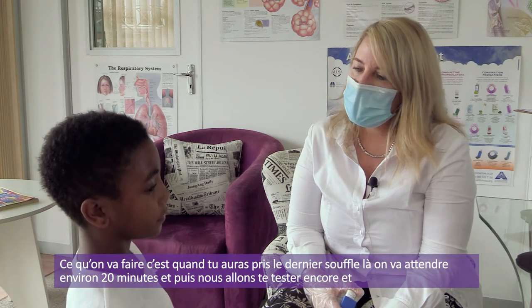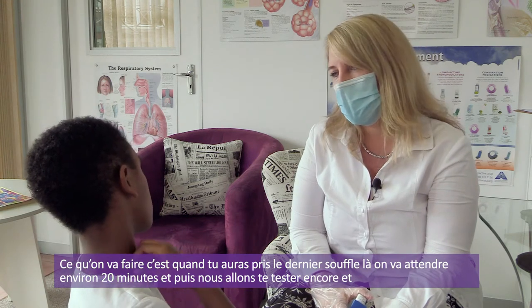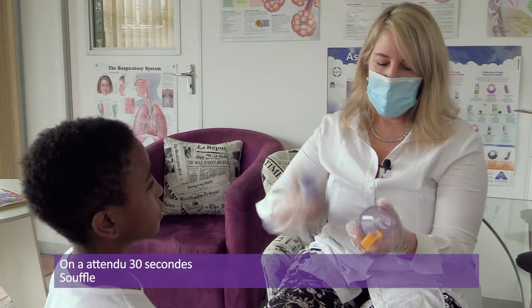So what we're going to do is when you've taken the last one now, we're going to wait for about 20 minutes and then we're going to test you again. And we're going to see if this medication made any difference to your airways. Okay. Good. Okay. We've waited 30 seconds. Let's do our last one.